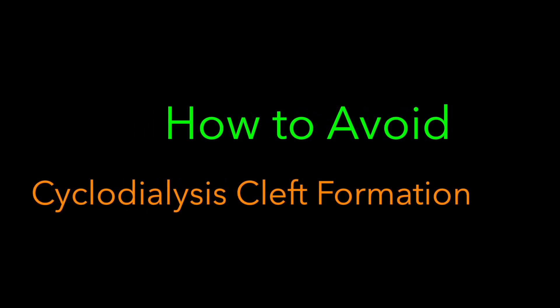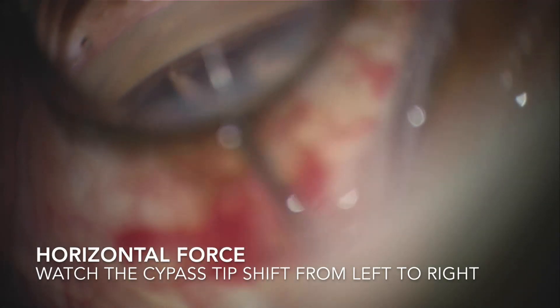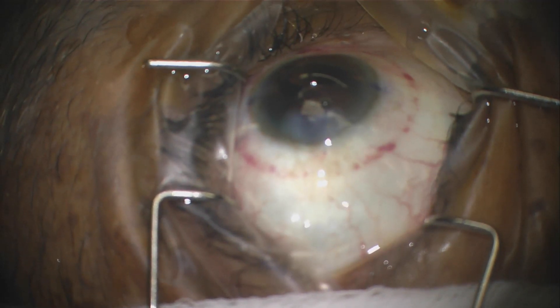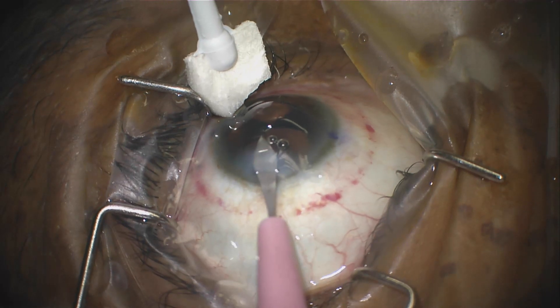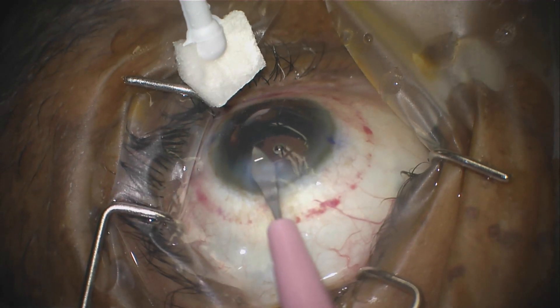Finally, my steps on how to avoid creating a cyclodialysis cleft. I believe that a large cleft is created when there is more than a perpendicular forward pressure on the tissue at the insertion site, but also an additional horizontal force that shears the tissues. My tips to avoid making these clefts are two. First, reposition yourself and your chair in addition to the microscope so that you can be directly perpendicular to the target tissue, which is at the two o'clock position. Step number two is to make an internal groove in the internal corneal incision in order to have complete ability to insert the CyPass device directly perpendicular to the tissues, without any need for twisting or torquing that could result in horizontal pressure or force. These two steps will help make sure that you can avoid those cyclodialysis clefts.